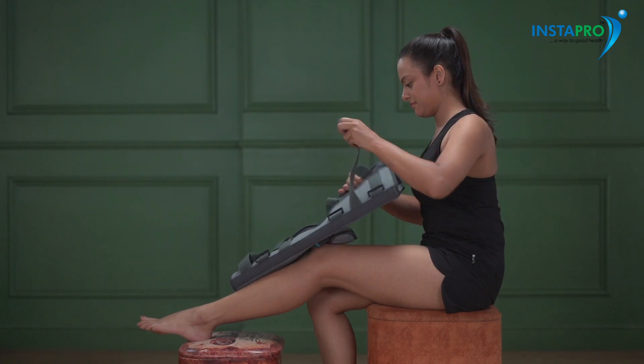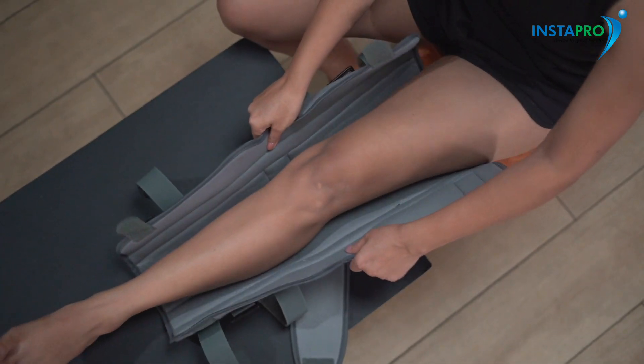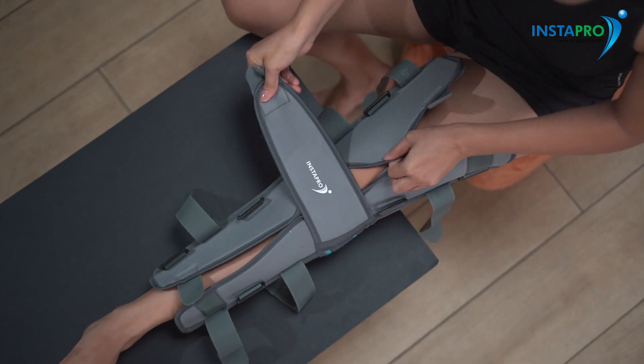Unfasten all the Velcros. Place it below your knee on the back of your leg and begin fastening the Velcros one by one. Fasten the middle strap first to hold the immobilizer in place.